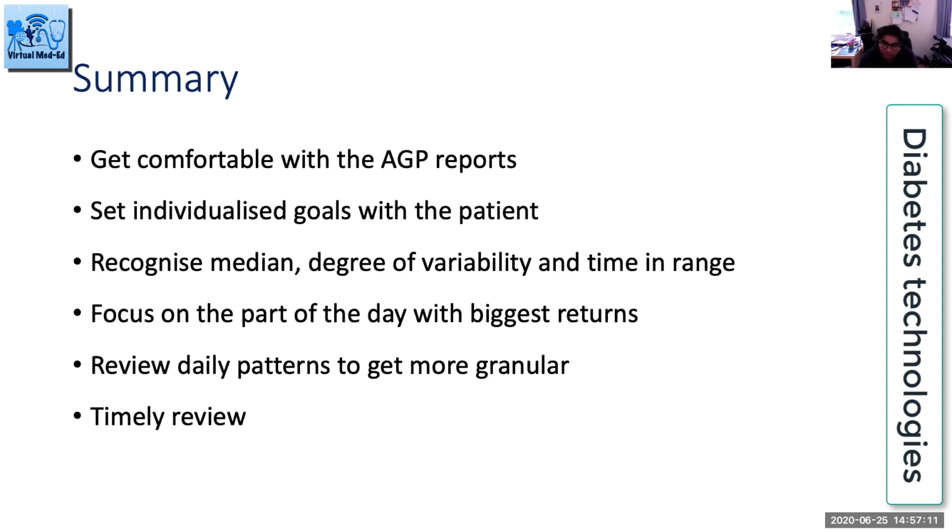But never forget to look at the individual days, because sometimes you can get certain clues. Those are the granular data that it would be worthwhile going in, having a quick glance at, because it might influence or inform you what needs to be done, and timely review. So really take full advantage of virtual clinics. There's no point seeing a patient and then 6 months down the line they get seen again, you've missed the opportunity. So we try our level best to get our diabetes nurse to see them within 2 to 4 weeks and upload the data and see how things are.